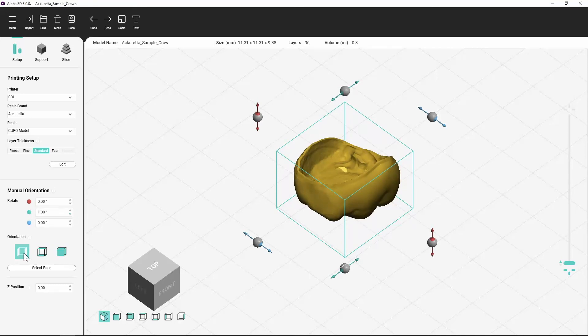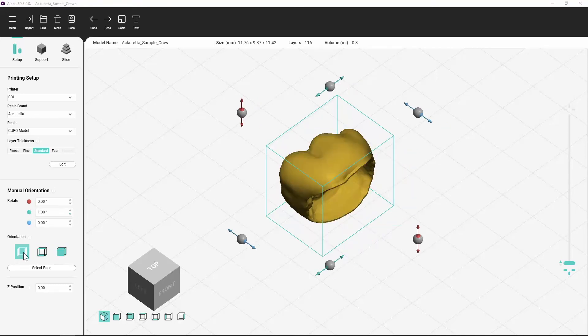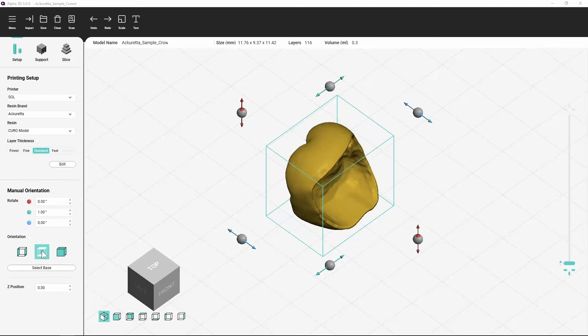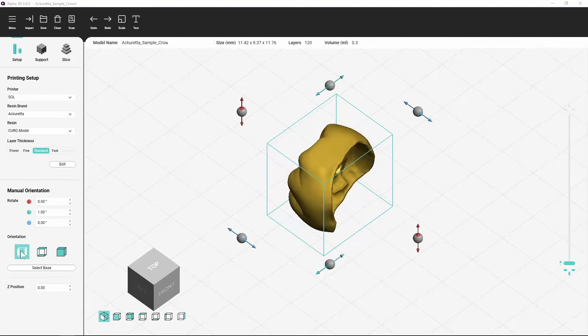Click the orientation preset buttons to snap the object into the related position.